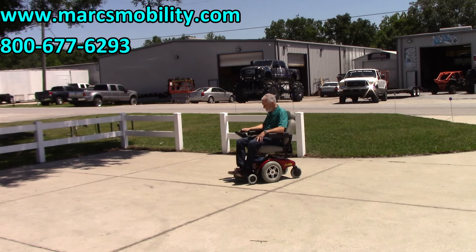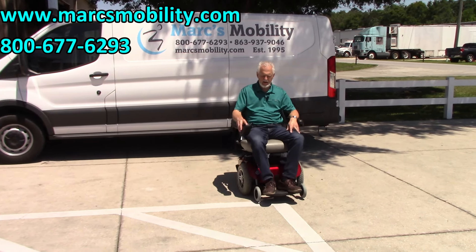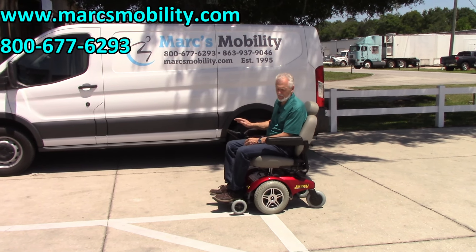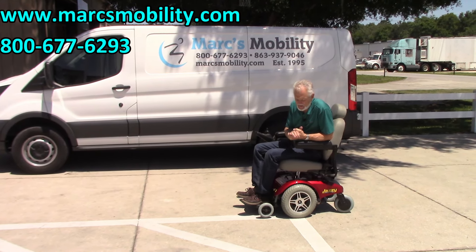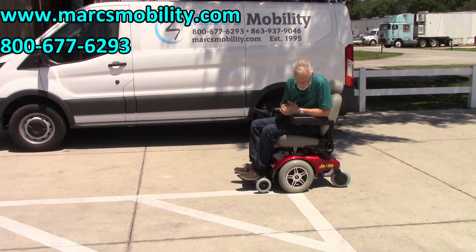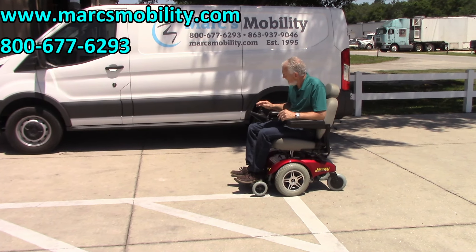This is the Jazzy Select 14XL. It's got 400-pound weight capability, solid tires, and a top speed of 4.5 to 5 miles an hour — a very nice power chair. This is the one with almost no miles on it: just a sharp-looking power chair, and it's ready to go.